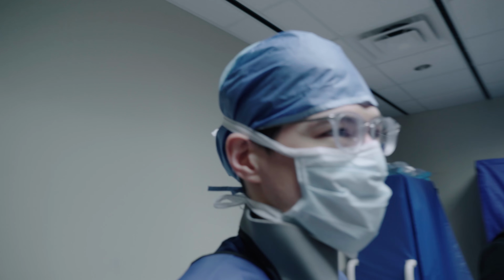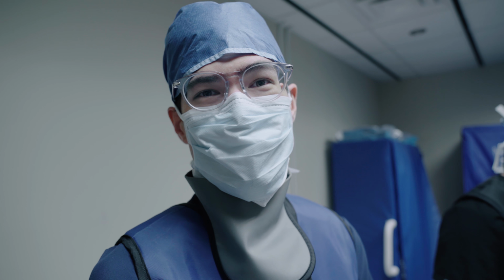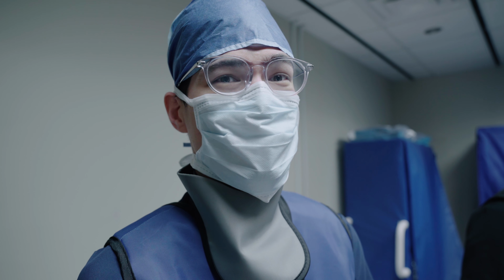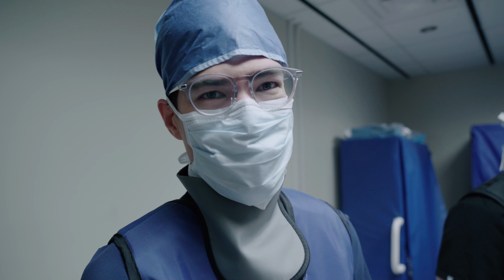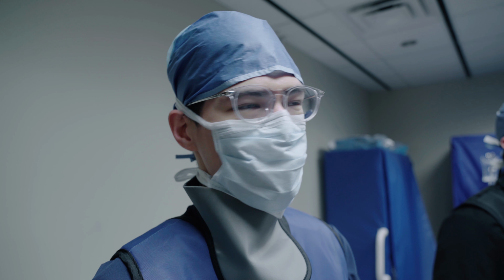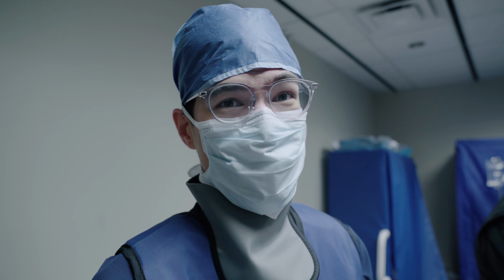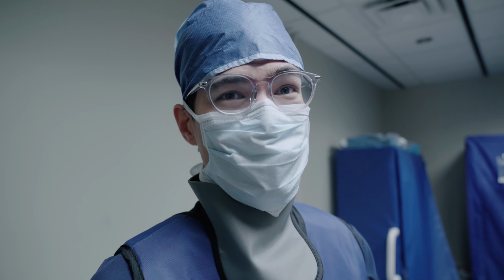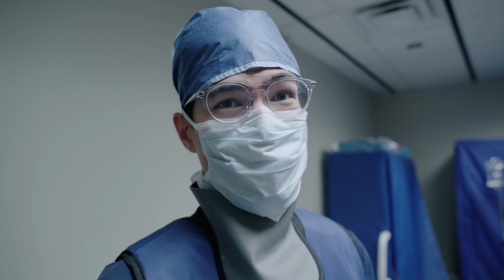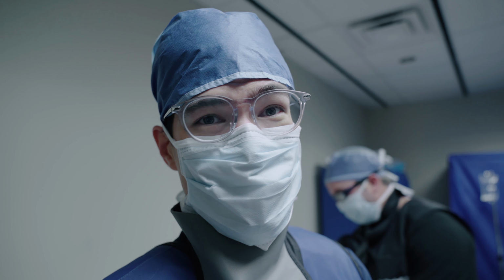And then we'll go interview Dr. Jim Rinaldi. So one cause of lower back pain is arthritis in some of the small joints called the facet joints. One of the ways we can treat that is to do nerve blocks for the nerves that supply those joints. What we'll usually do is something called a medial branch block. Once we confirm that that improves the patient's symptoms, then we can do a more permanent solution called a rhizotomy or a medial branch nerve ablation. So that's what we're doing here today.